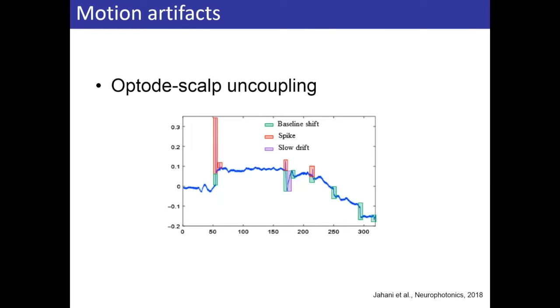So there are various ways of identifying motion artifacts in the literature. And this figure is from a paper we published in 2018 that shows different types of motion artifacts: spikes, baseline shifts, and slow motions. I have also already shown that in the previous slide, but here this is a spike. The red ones are spikes. Baseline shifts are shown in green, so there's a change in the level of the signal, and there are slow drifts, which are much more difficult to detect, by the way.